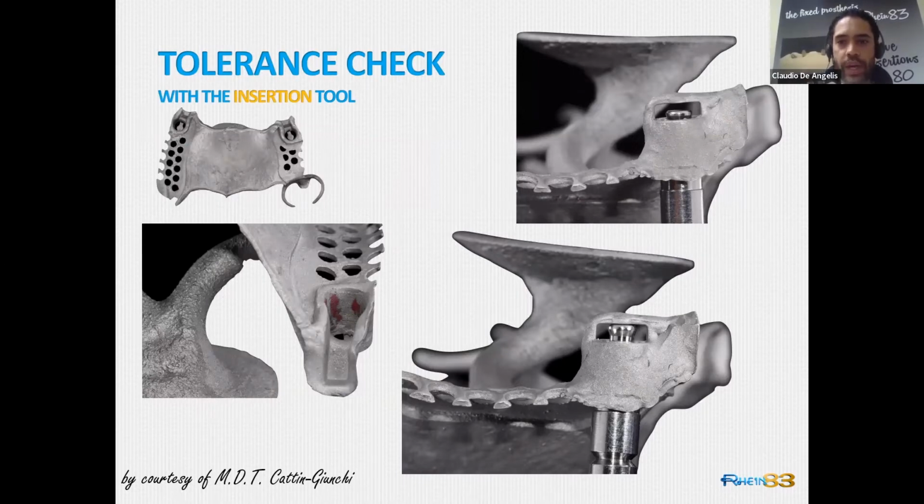I show you a tip, a trick, not a tip, a trick. The insertion tip this time, the insertion tip of the retentive caps, the blue tool I showed you a few minutes ago. The insertion tip is a calibrator for the housing, for the metal housing.